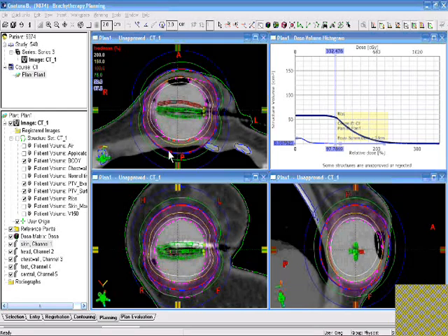There have been sporadic reports of rib fracture and chest wall pain after these. Generally, it's a late toxicity, but it's not well correlated with doses calculated to those structures. So we don't know for sure. That's why there are recommendations for dose to the chest wall and ribs to keep them below 140%, something like that.